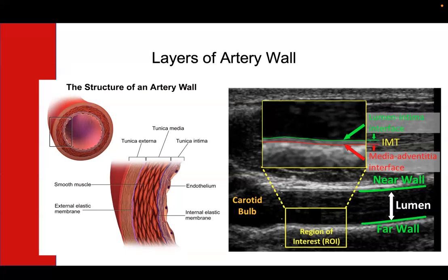The outer layer is the external coat or tunica externa, sometimes called the adventitia. On the right, you can see an ultrasound image with the walls of the artery marked by the green line and the inside of the artery, called the lumen, where the blood flows.